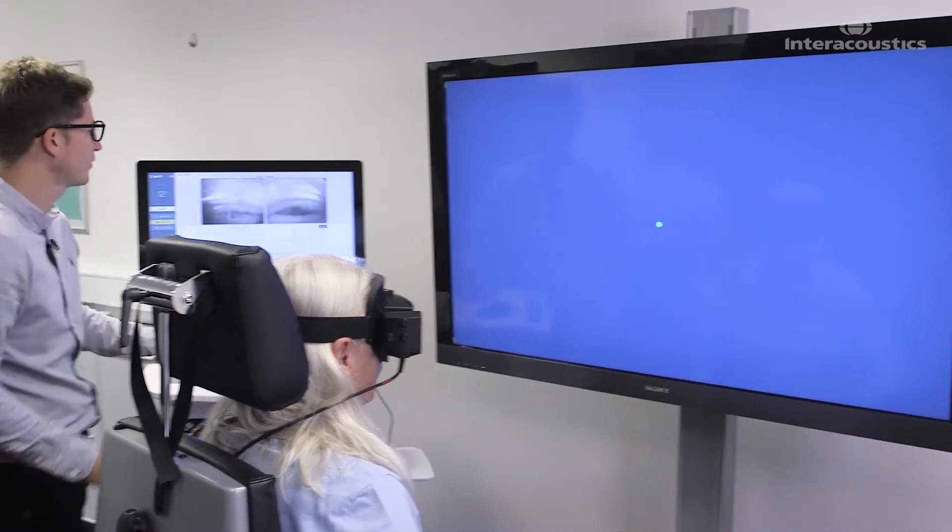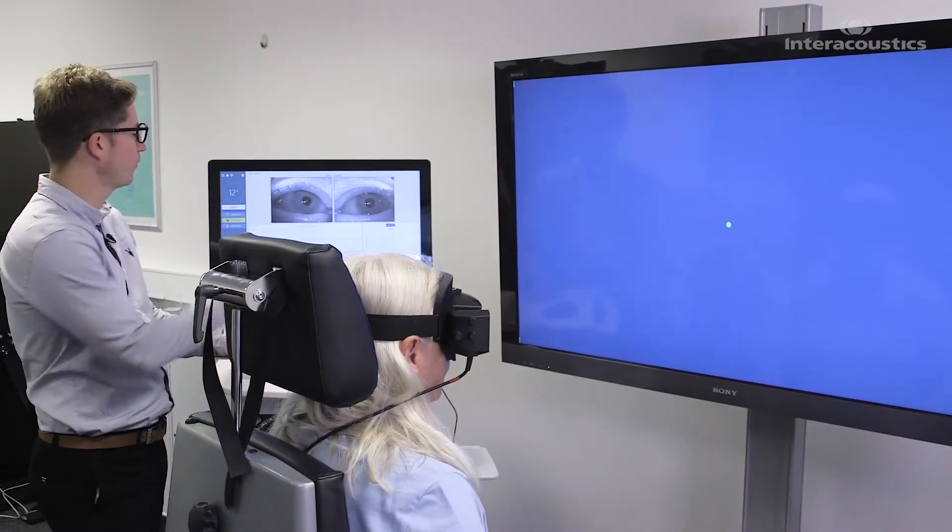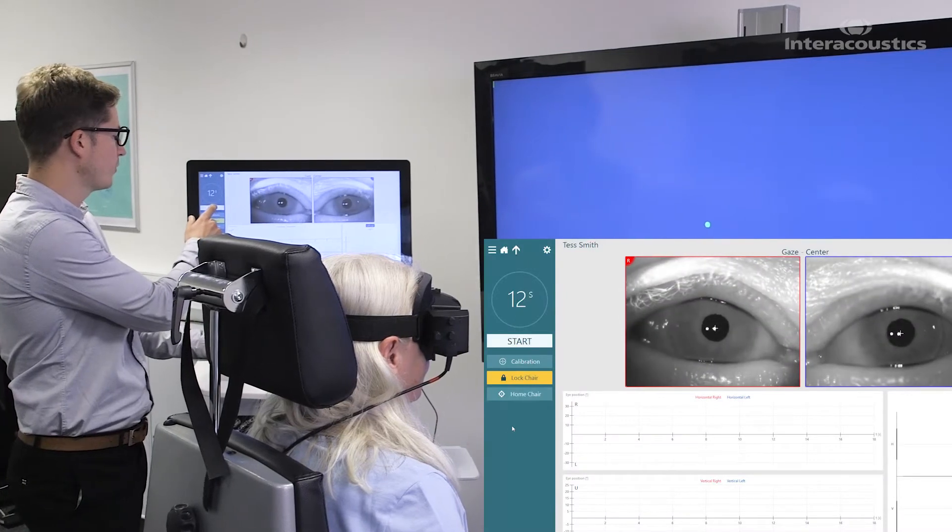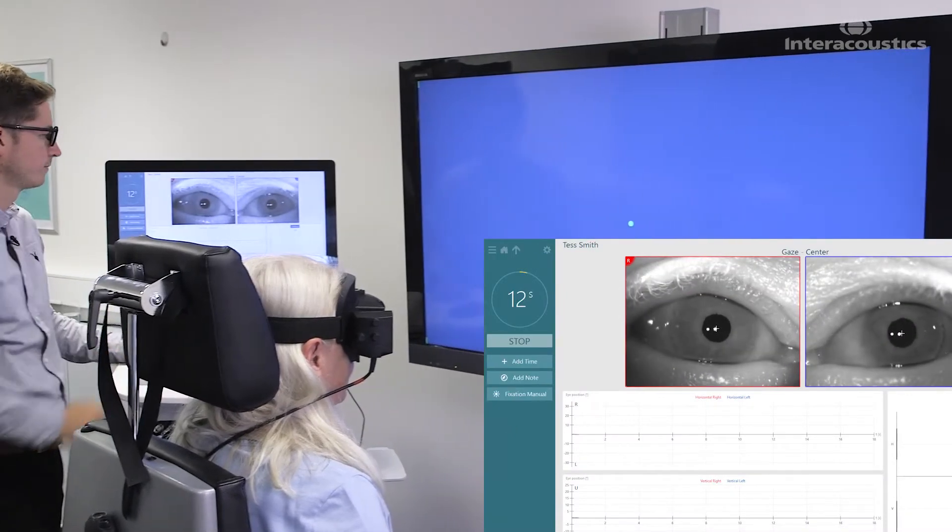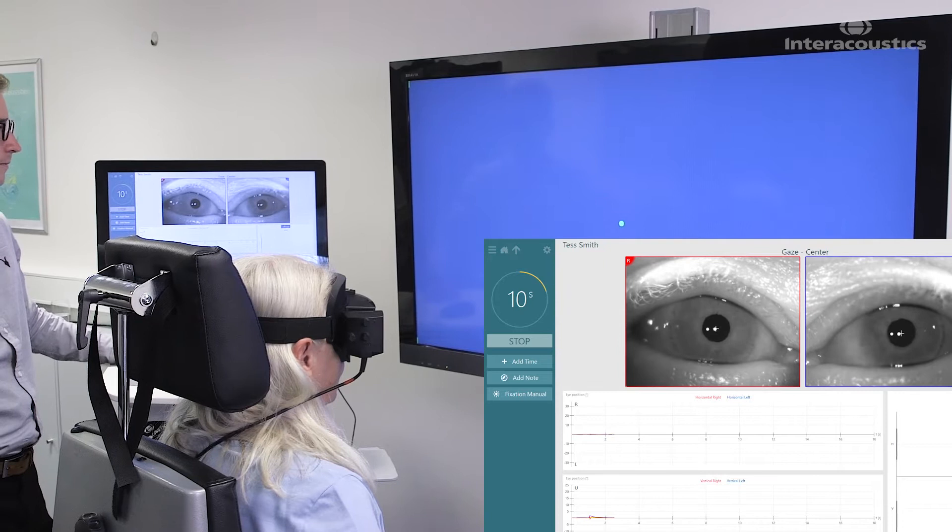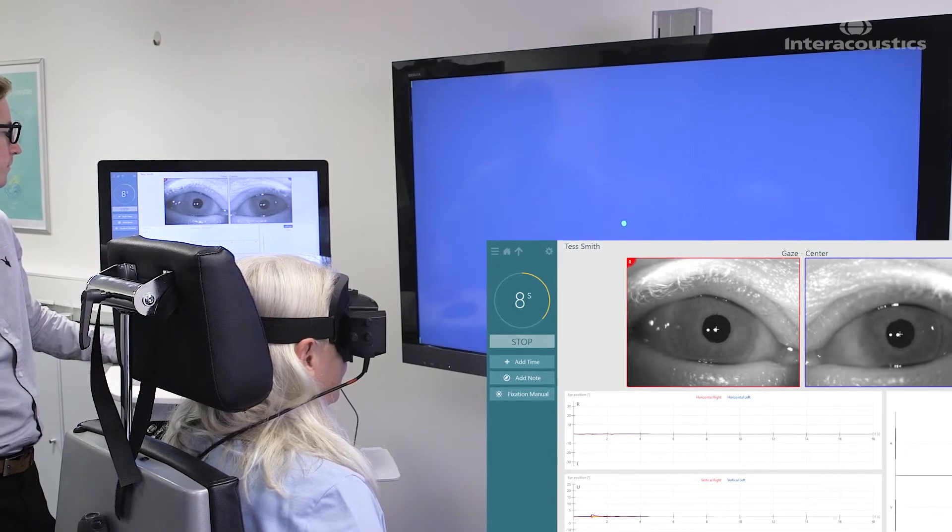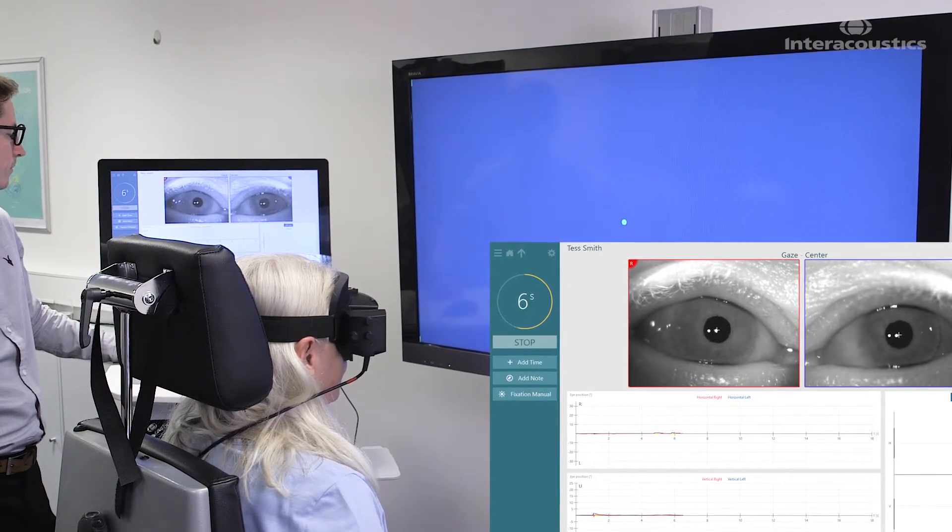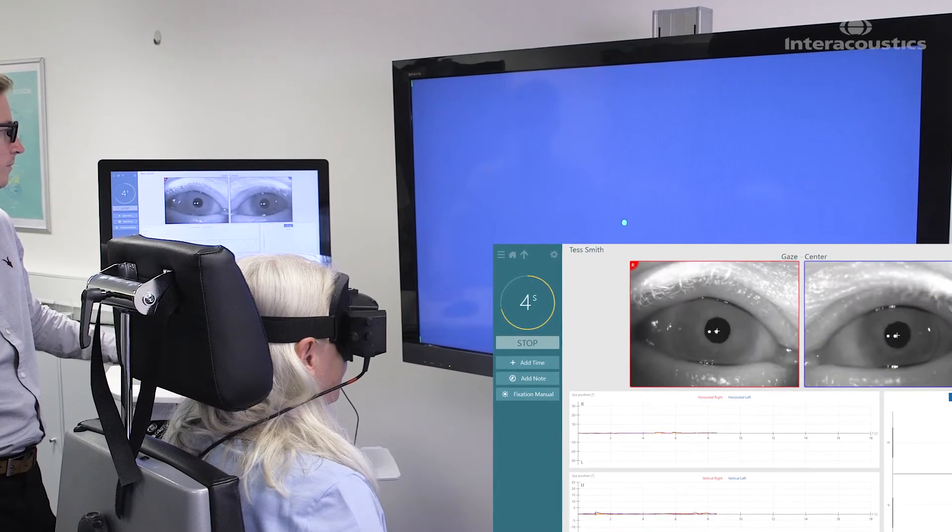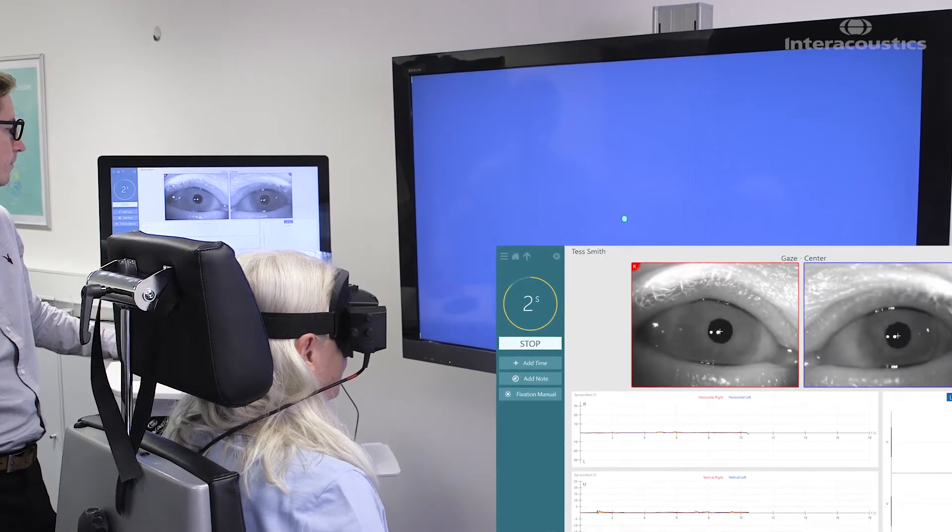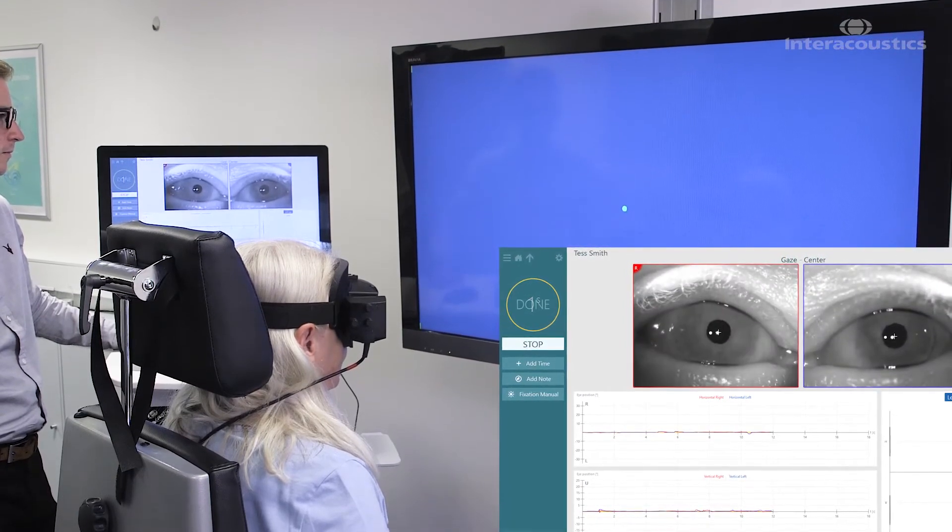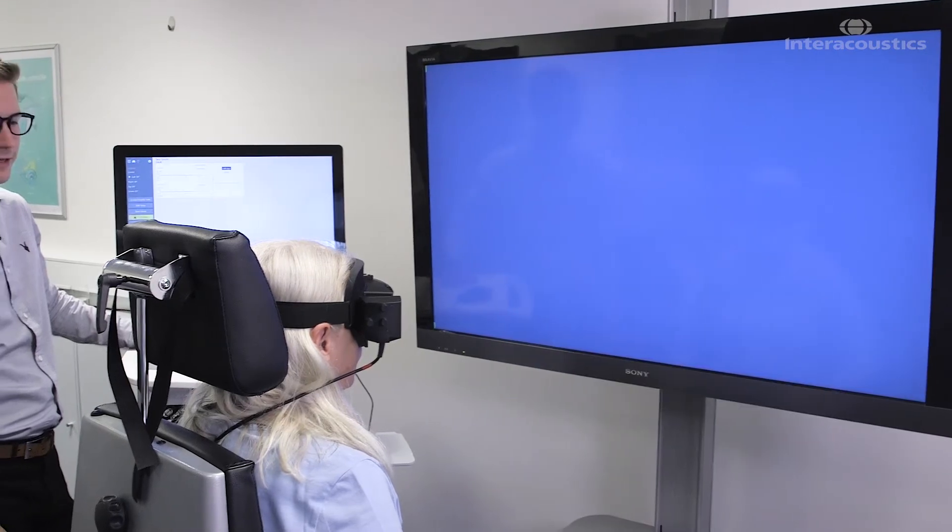So if I can ask you to have a look at the center dot for me please. Eyes open and here we go. Counting down from 12. Zero. Fantastic.